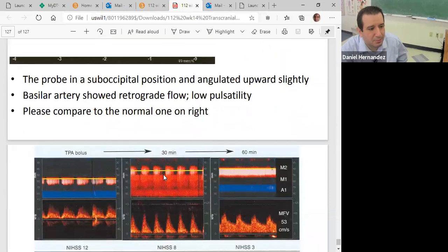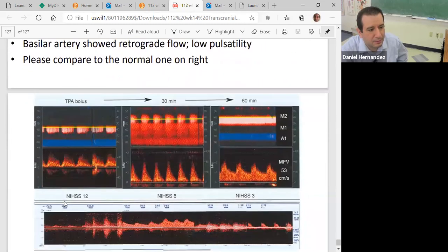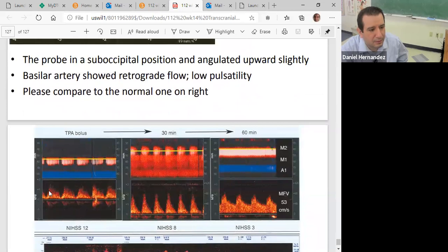And you can see our progression. This is our M mode, then this would be our Doppler tracing, and then we get a slow return back to normal.